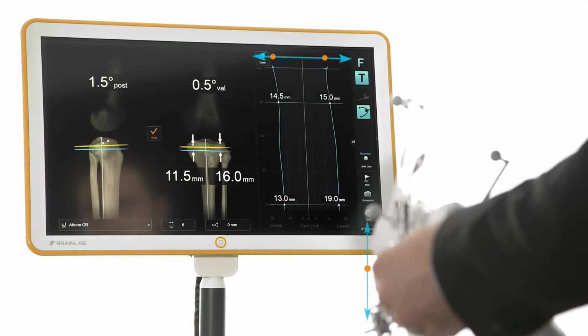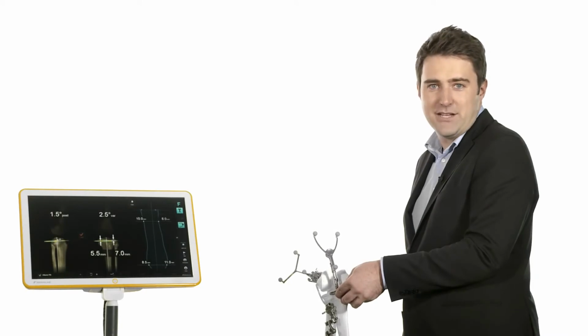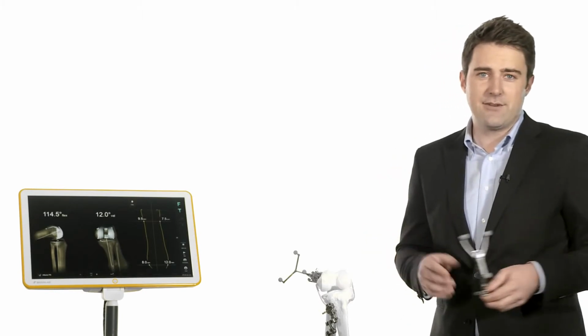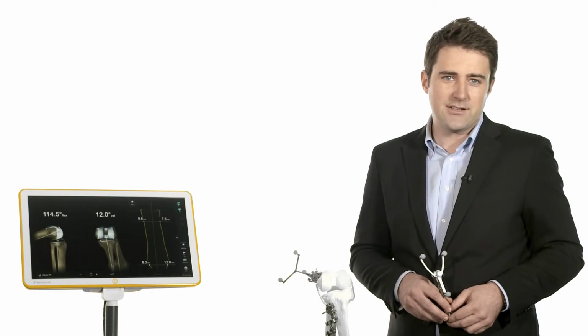This patient-specific navigation allows the surgeon to foresee the outcome of final joint stability based on the implant geometry and according to previously verified cuts. Surgical interactions such as soft tissue releases are immediately taken into account.